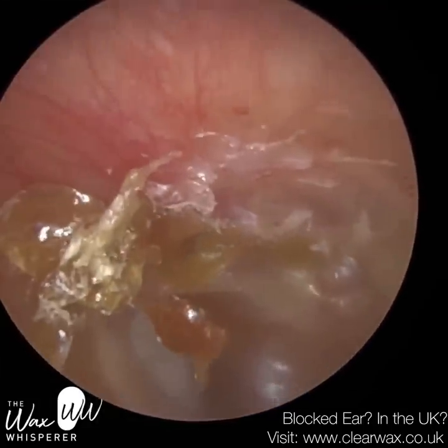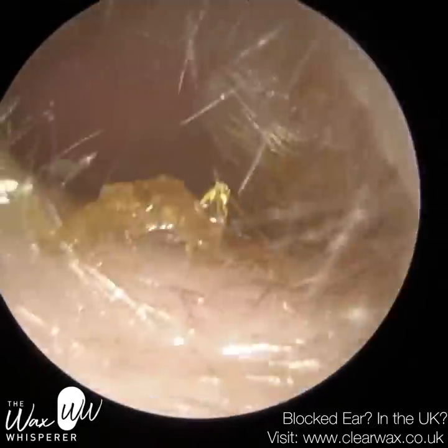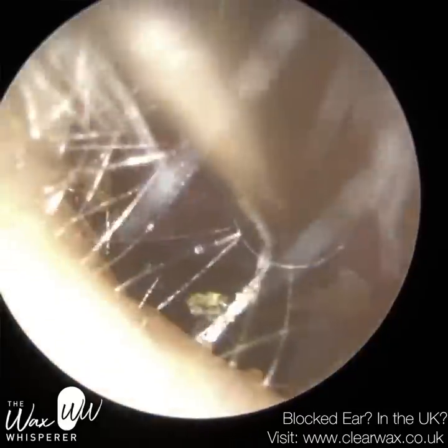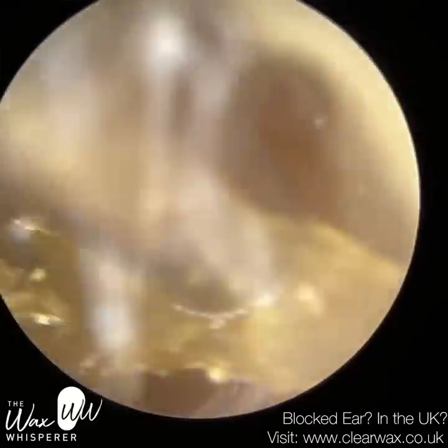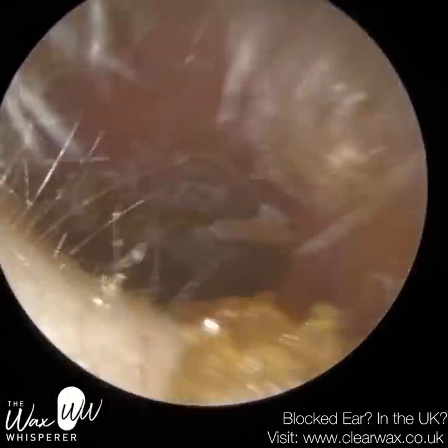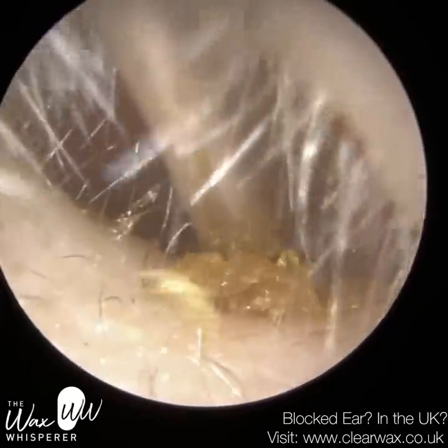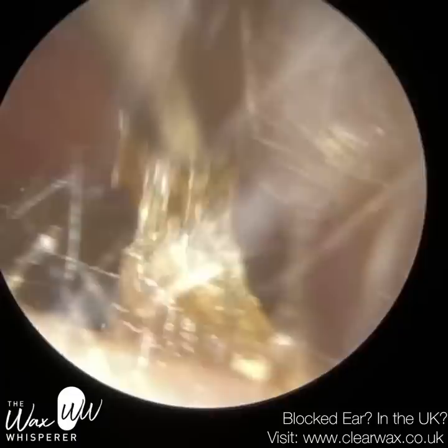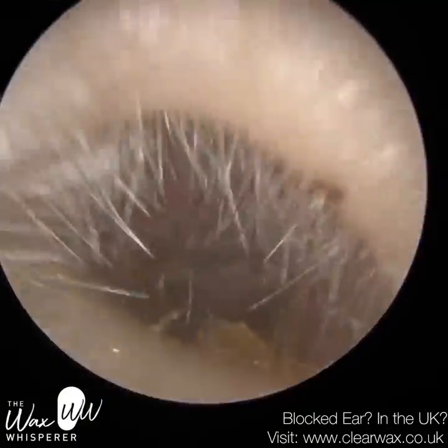So that's the patient's eardrum already. There are alarm bells ringing because you've got this dead skin located in the posterior superior quadrant, which in the case of the left means the northeast region. And that part of the eardrum is very susceptible to becoming retracted, as is the attic — the top, around 12 o'clock. When we say retracted, we mean the eardrum can be sucked and buckled inwards due to negative middle ear pressure.